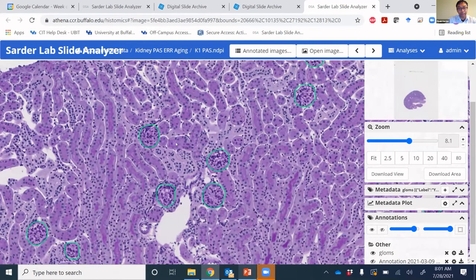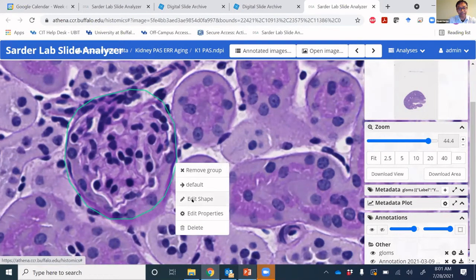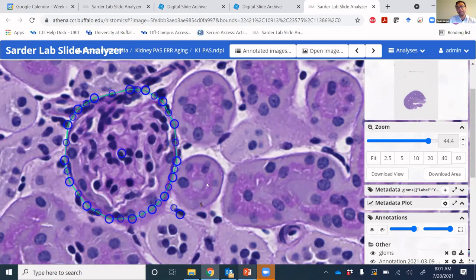So one beauty of the system is we have incorporated this structured segmentation capability. Namely, because of the tissue variability, and because of how pathologists operate, they may not agree with this structural boundary, and one is able to correct this boundary. We can improve this boundary correction procedure, but right now this is what we have deployed. And the whole idea here is if you can correct this, then you can retrain the system. I will talk about that later.